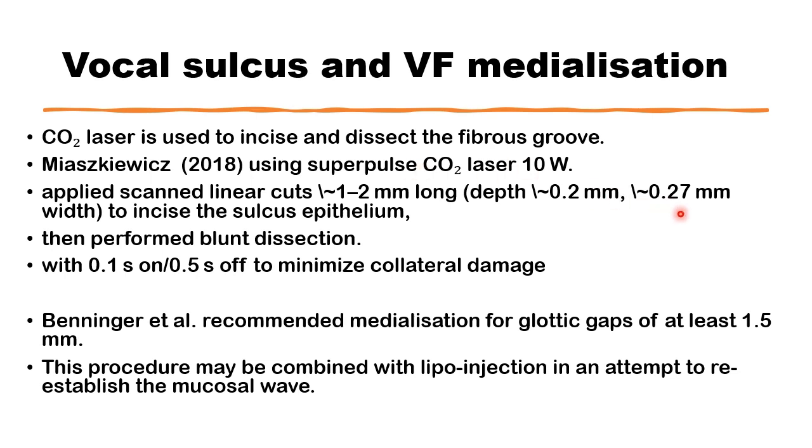Once the epithelium is detached from the surrounding vocal folds and from the deeper part of the groove, they can be dissected meticulously from the bottom of the groove and the vocal ligament if it's attached to it. This can be carried out with blunt dissection.